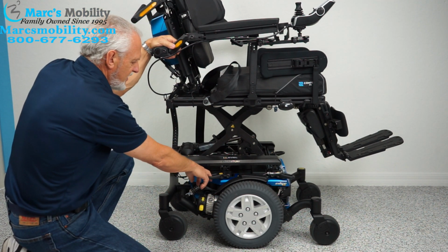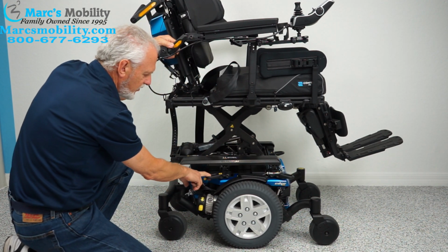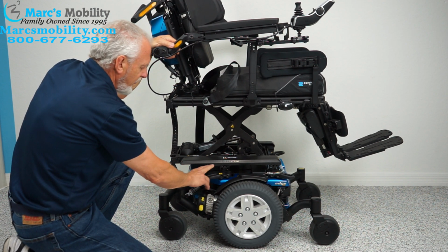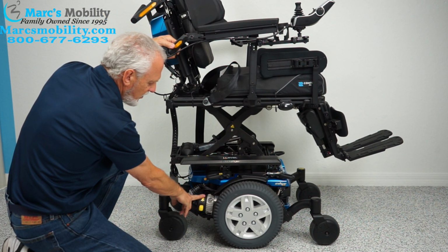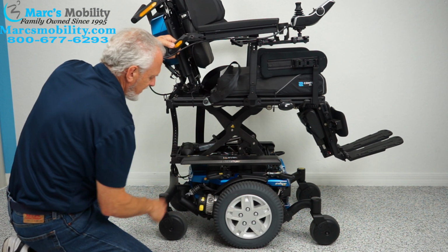okay? You have these anchor points right here, 1 here and 1 here. This is where you secure your chair to your lift if you're going to transport this chair in your van or on your lift. You have 4 of these, 2 on this side, 2 on the opposite side. You've got these HD motors. These are heavy duty motors for each wheel. You have one on this side and you have another one on the opposite side.